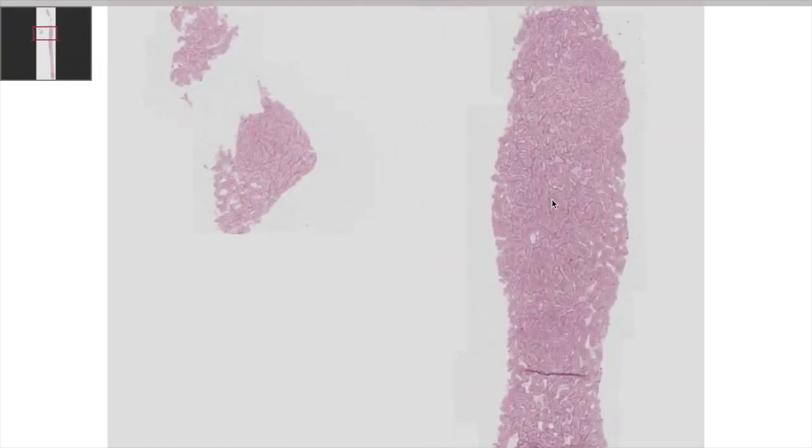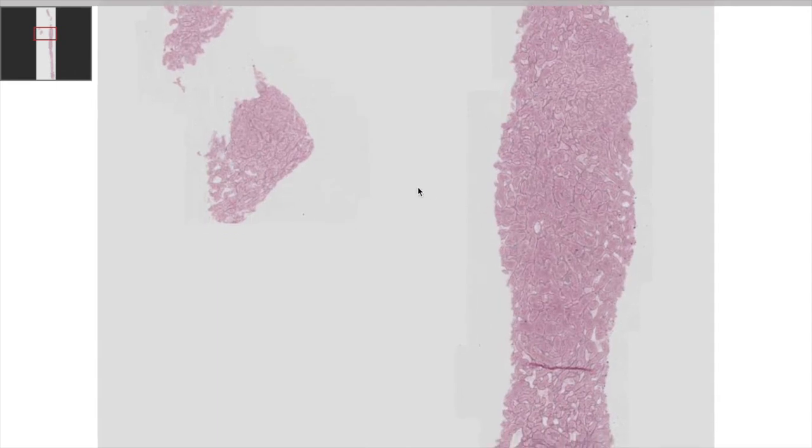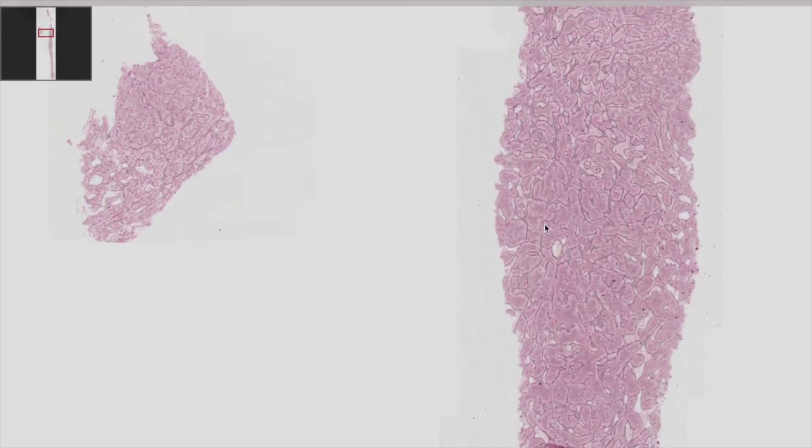So here is the reticulin staining that will allow us to differentiate the regenerative areas from the areas with more atrophy with thinner trabeculae. And you have here on this staining nodular areas, and here the areas with the thin trabeculae.